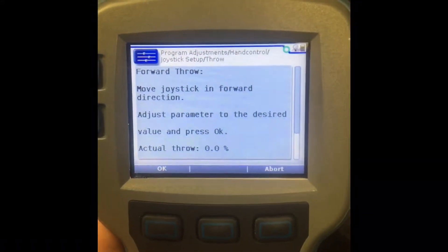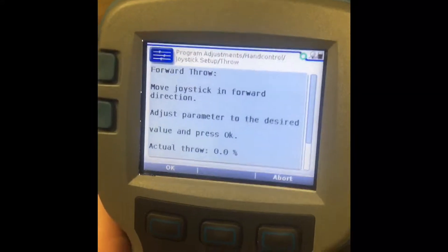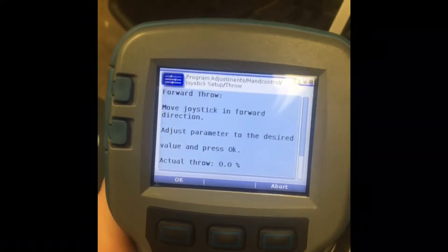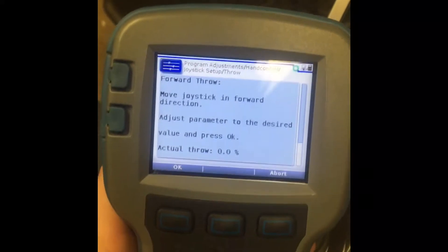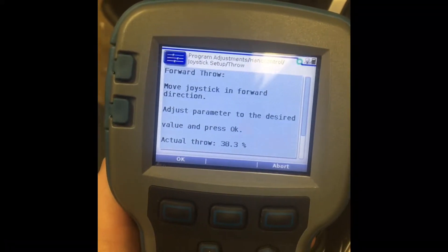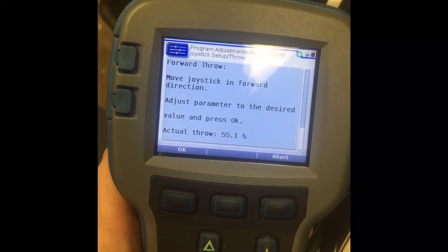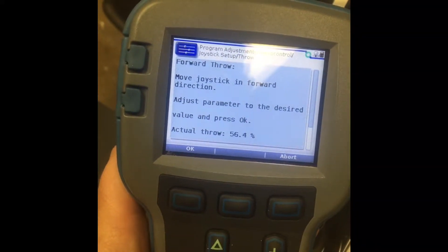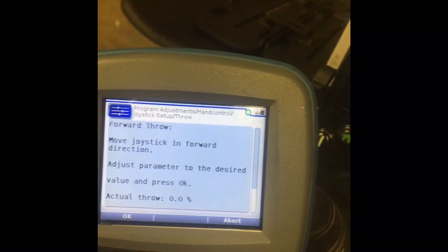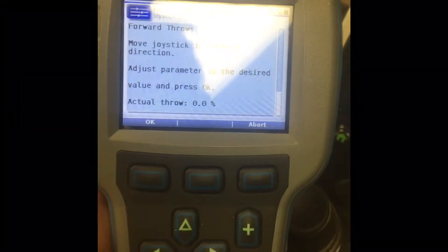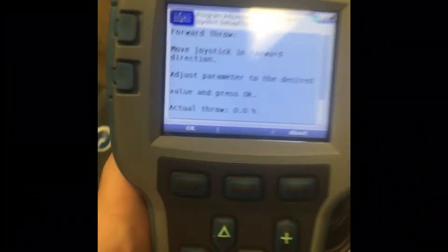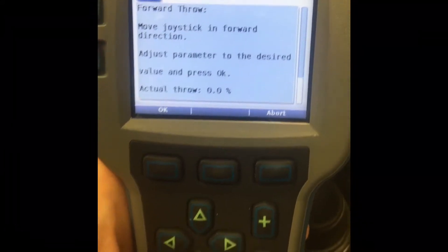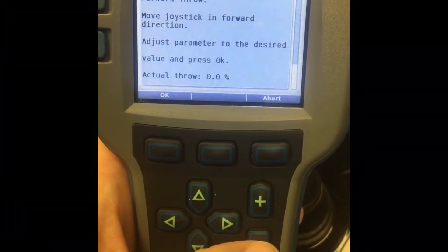You can't follow the directions on here until there is an update, but if you move the joystick in a forward movement, you can get an idea of how far you need to go. But you have to click the down button.